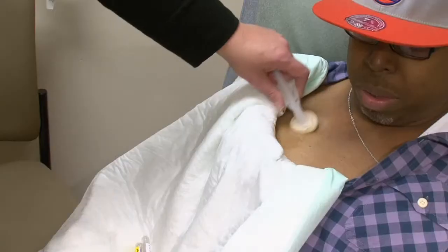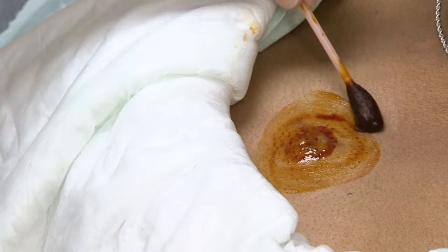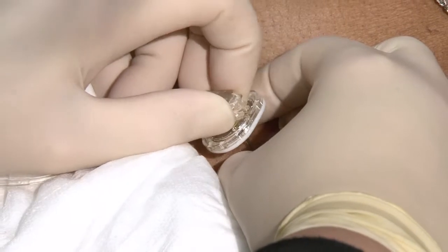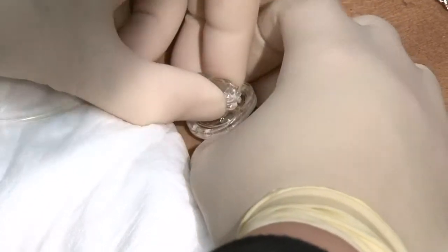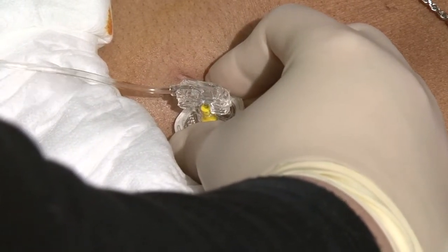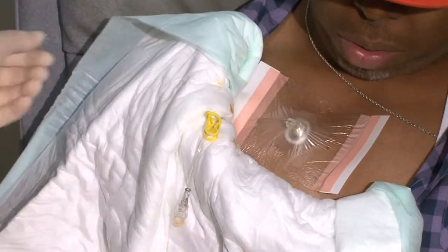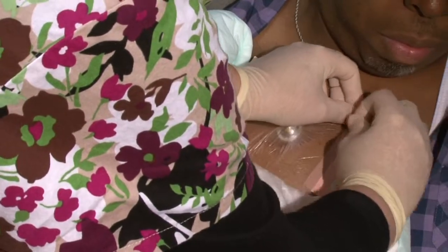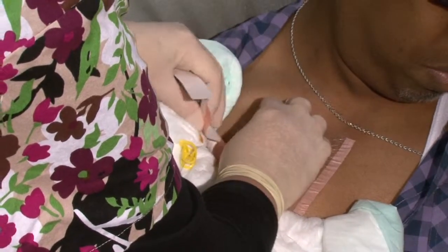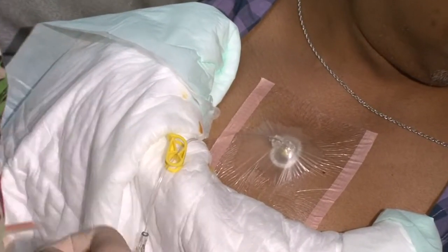Agencies may use chlorhexidine or a combination of alcohol and an iodine solution to clean your skin. Either method is acceptable and safe. After the area over your port has been cleaned, the provider will insert a special needle through your skin. In some cases, this needle will be left in place for continued use of your port. This needle will have to be changed at least every 7 days or if it becomes dislodged. It will be secured to your skin with a dressing. The dressing should cover the access needle and port site at all times. The dressing will be changed every 7 days when the needle is changed, or if the dressing becomes loose, begins to fall off, or if the dressing becomes soiled with blood or fluid.